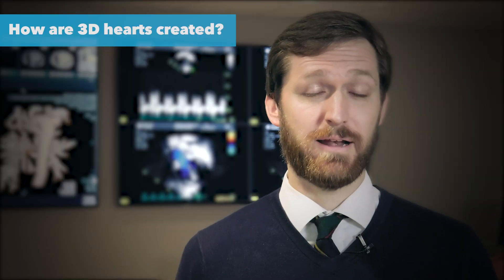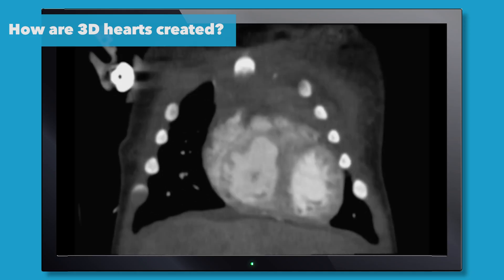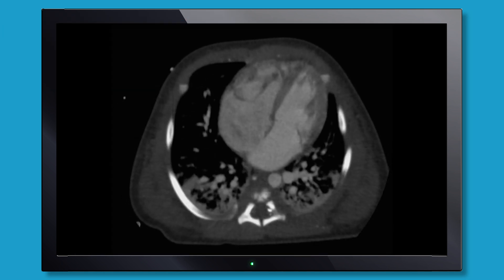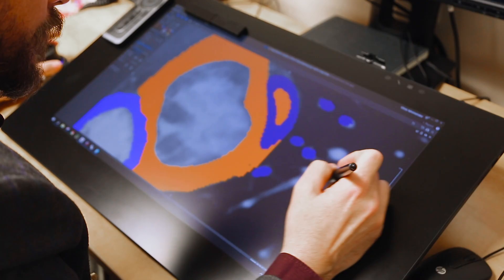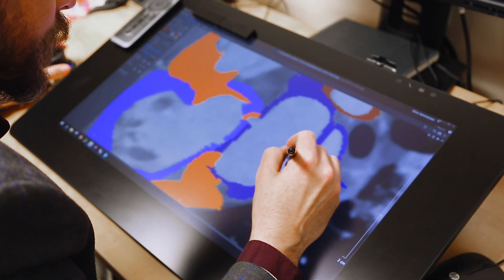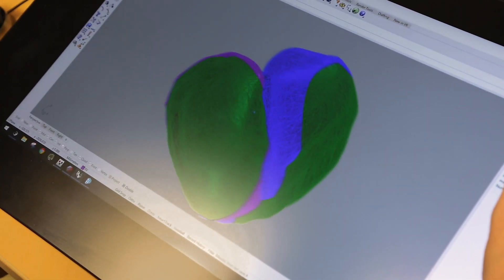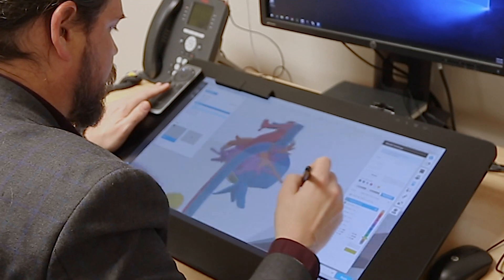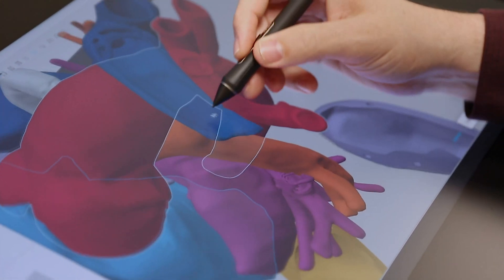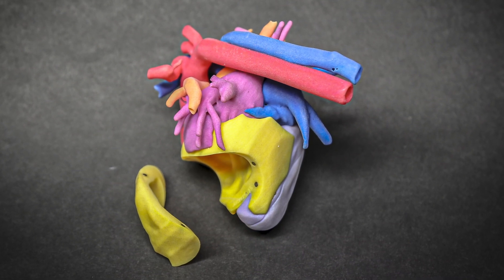To create a 3D print, we actually start with a CT scan most commonly, but it can also be a cardiac MRI. We use that data set to do a very detailed segmentation, or identification of which pixel belongs to which part of the heart. We're then able to print each of these structures in their own individual colors.